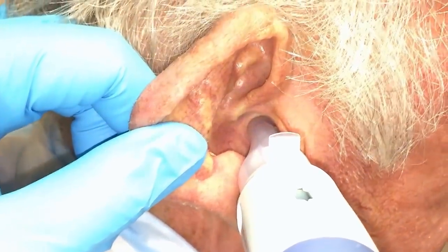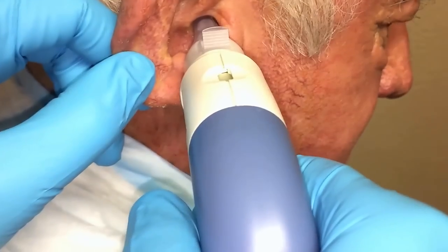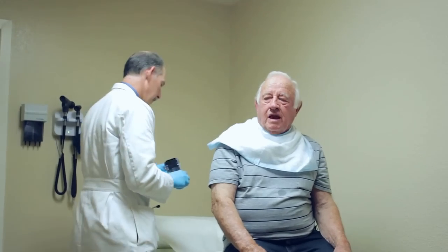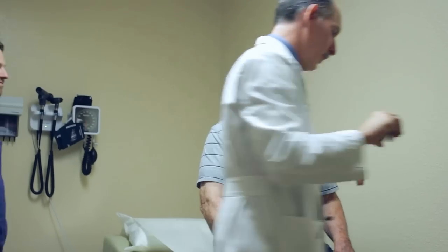It's going now. How does that feel, Ralph? Feels okay. [pause] That's how we got a drop. It does look a lot better. I'm seeing the eardrum way, way in there. There's still wax in front of it, but I can understand that you feel like it's cleared up — like you can hear better. Let me take a look on the other side too.